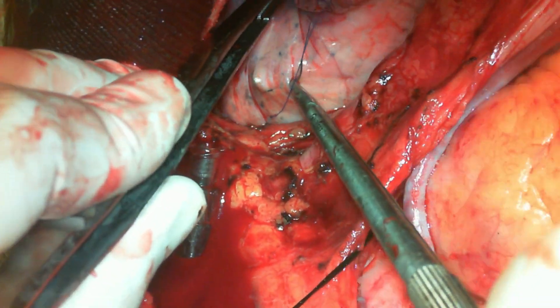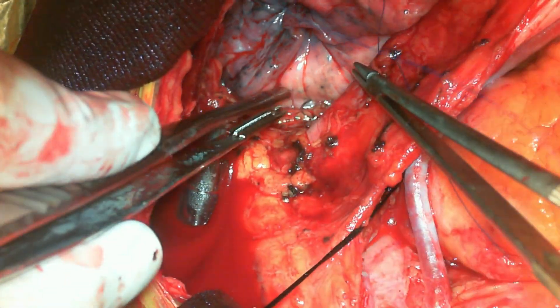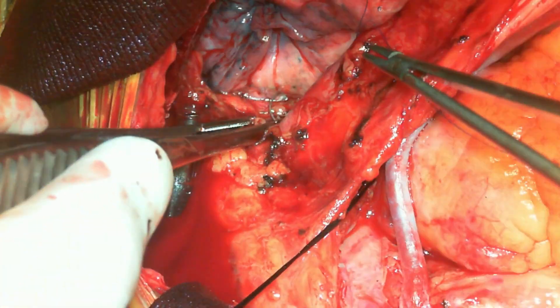I will tie it so that the left upper lobe of the lung will stay away from the LIMA, even when the patient coughs.